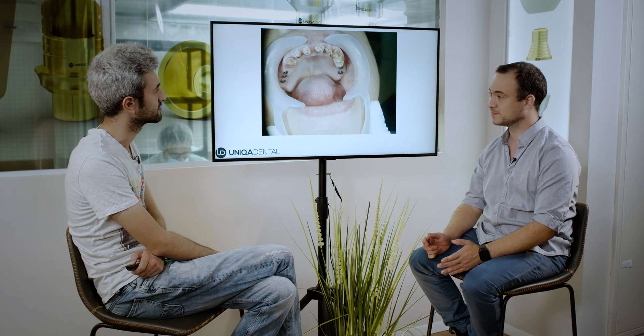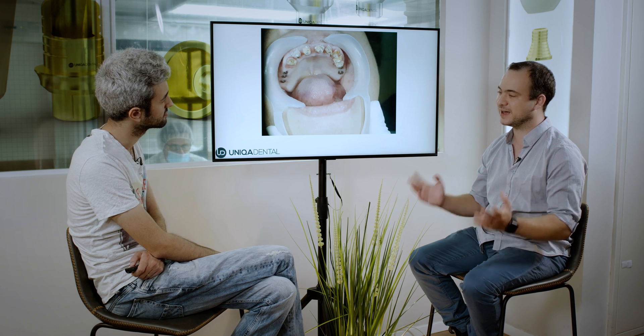In here you have a lot of bone, so you can just replace the old bridge with a new one, implant-based on enough implants. You have posterior implants — you just need to add three or four implants in the anterior area and you have enough implants to hold it.